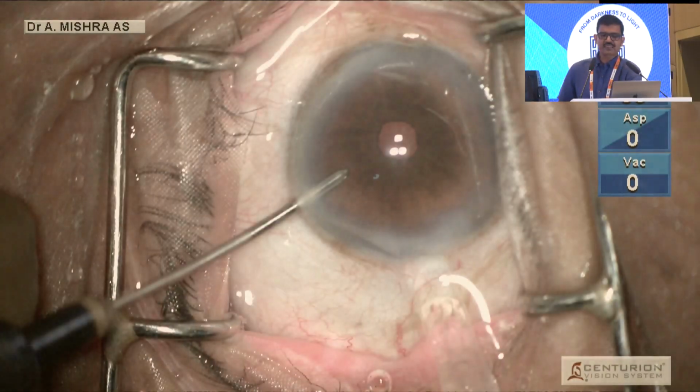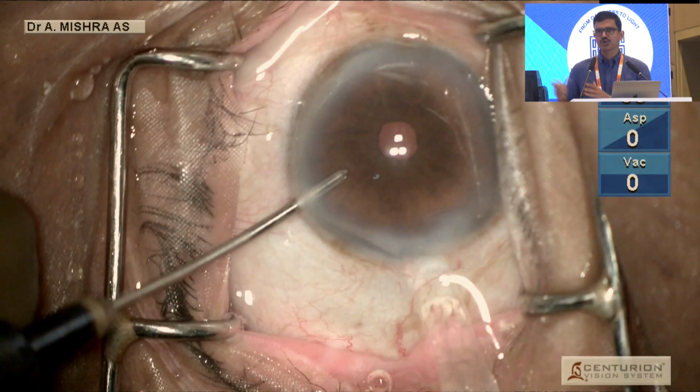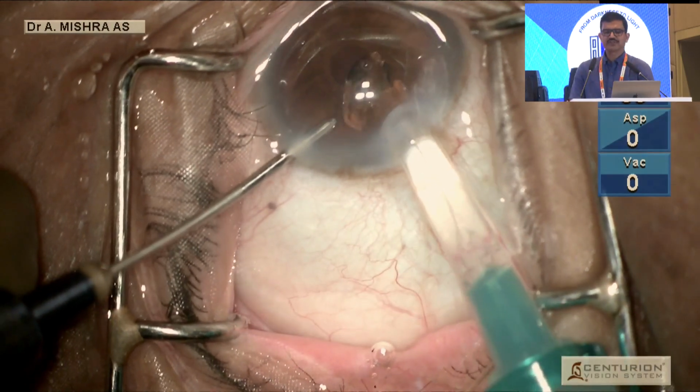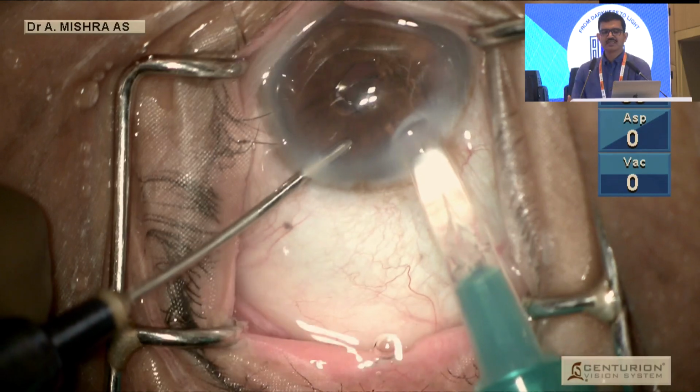Before I conclude, I'll just take 10 seconds extra. This is not pertaining to this particular segment, but when you have a very small pupil and you have the IOL implantation in question after the end of nucleus management, you don't really need to dilate the pupil anymore. The small pupil can also accommodate the IOL. This is the way I do it under the cover of BSS. The advancing haptic is first fed into the bag.